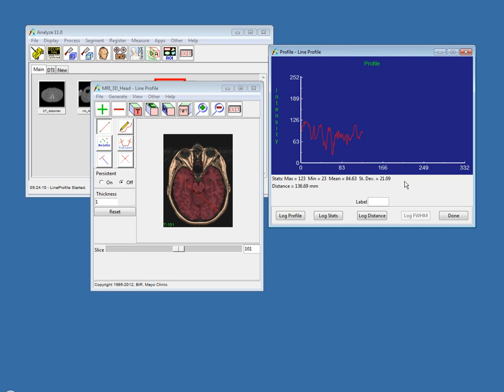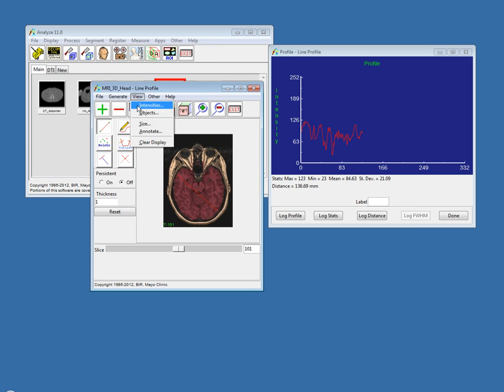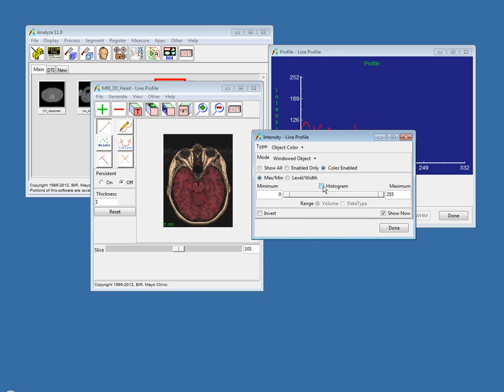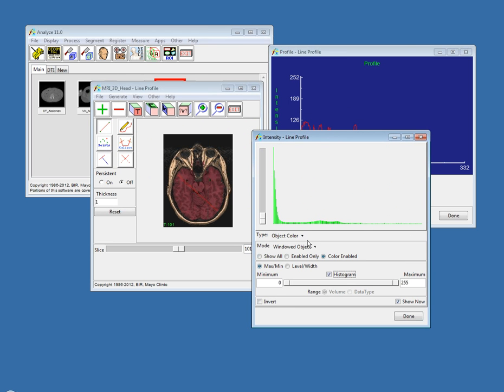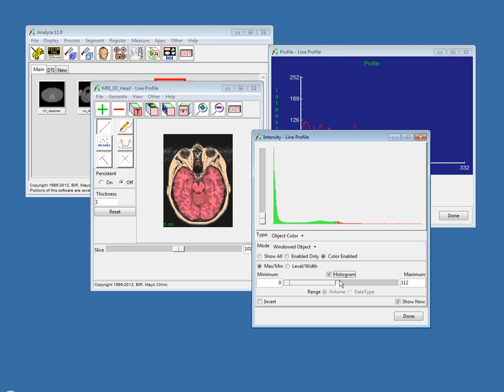The next question is about the histogram display in the intensity window. This is another new feature outlined in the new features and enhancements document. The intensity window is underneath view intensities. The new feature is a histogram option — if you check it, you automatically get a histogram of the intensity values in the volume. You can control the magnitude using a side slider. This is useful for determining how to set your window and for helping determine where to set a threshold. This option is available in all Analyze modules where you go to view intensities and check the histogram checkbox. It came out of a user request.